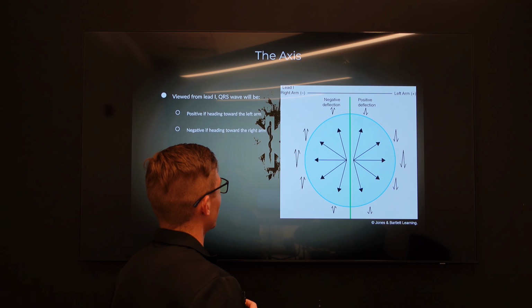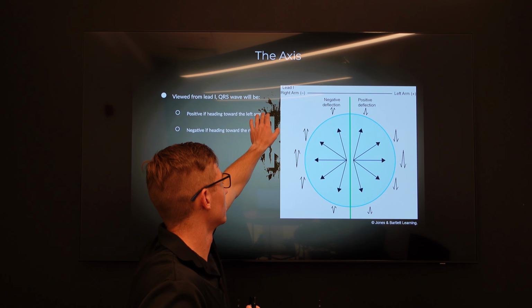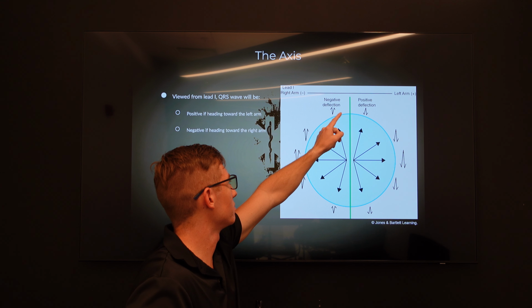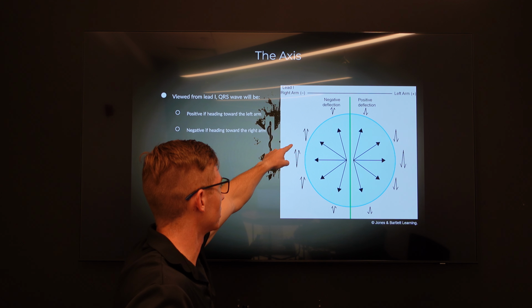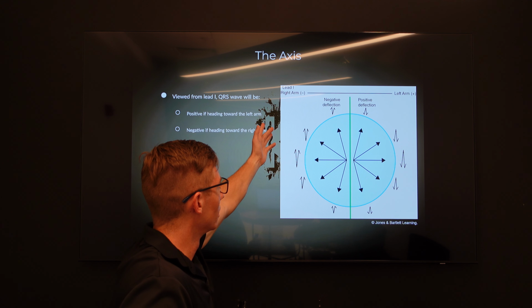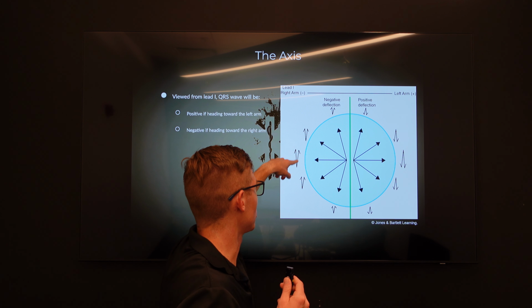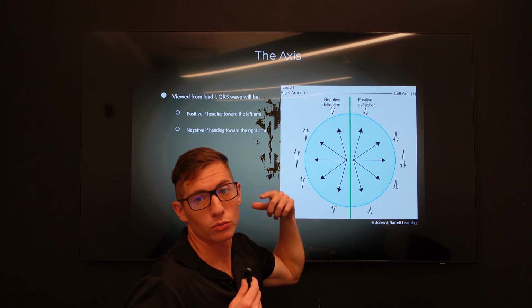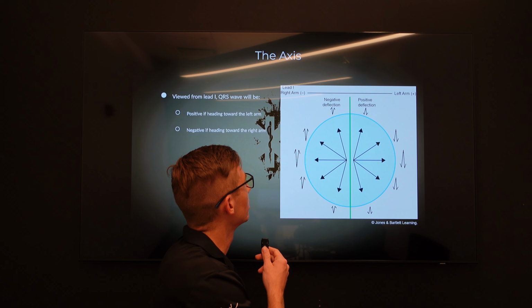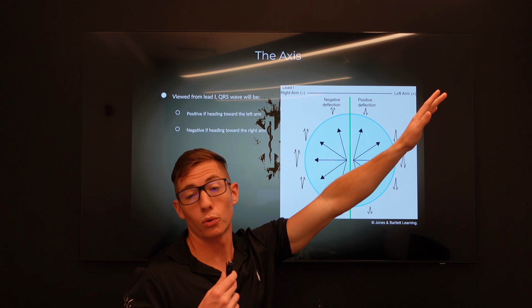This is confusing to look at. Okay, lead 1 over here. Lead 1 is going negative to positive, positive deflection, negative deflection. Okay, so we know if it looks like this, right? The QRS, if there's a spike going down, back to basics, electricity is going away from the lead. If it's going up, it's going towards the lead.